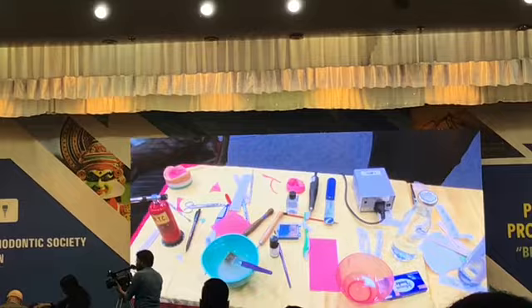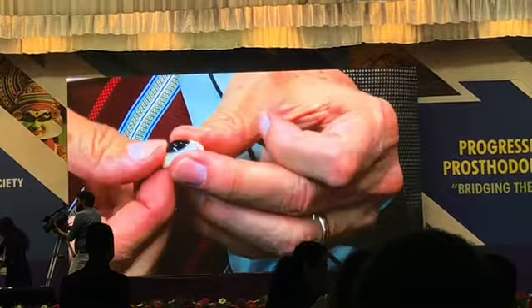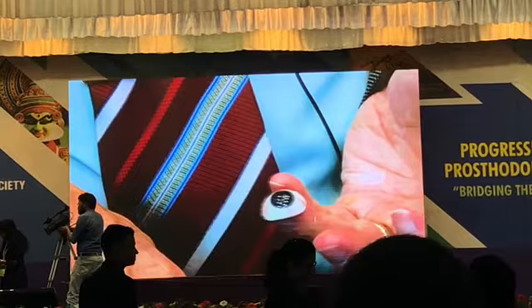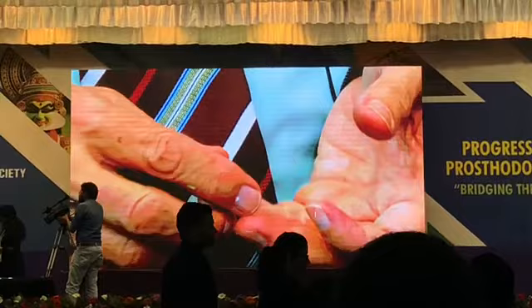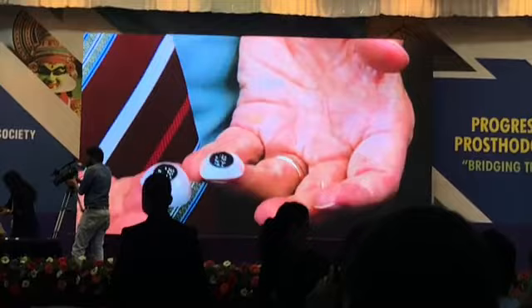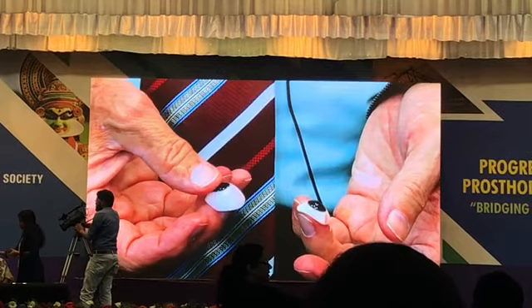Okay. Now, go ahead and take a picture of this globe right here. See this globe? It's been cut down quite a bit from what you normally would see. Give me the box of globes. Open it up for me. Just give me one. You can see here, when we started, we had something really big. But this one is too big to fit within the orbital content. So you generally have to cut it back quite a bit so you end up with something like that.